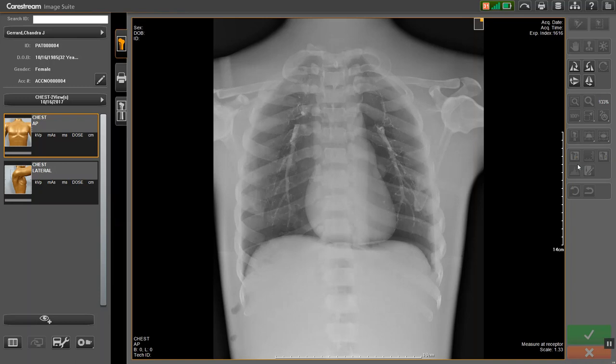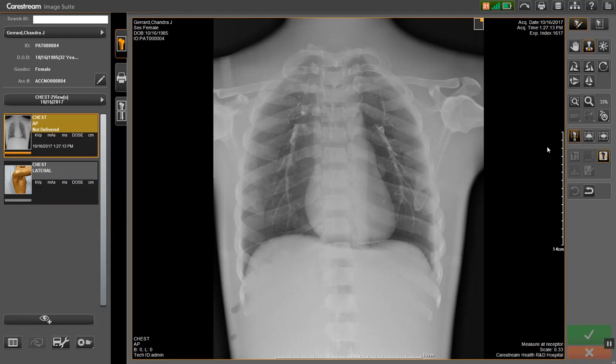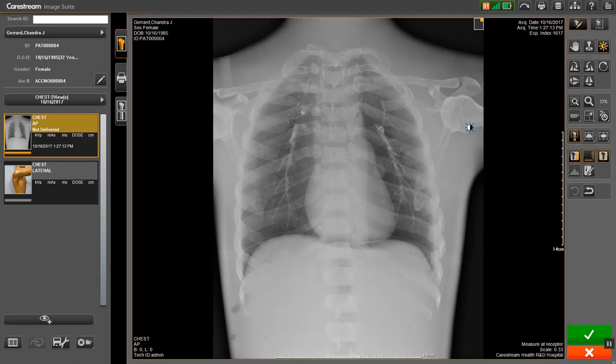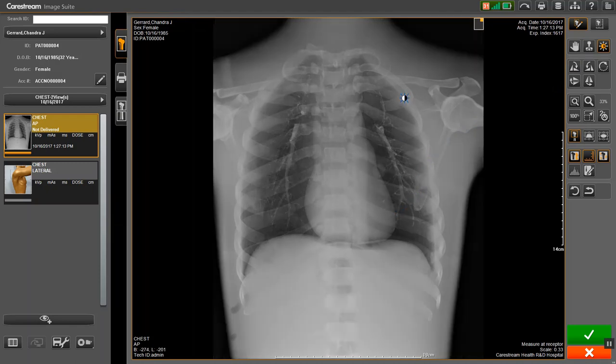Make any necessary adjustments to your image. Once you are satisfied with your image, click on the green Accept button.